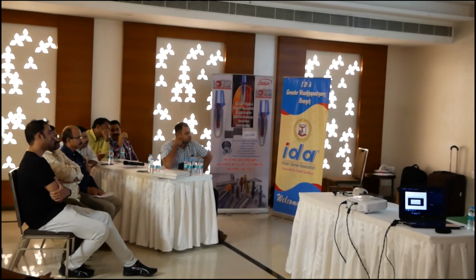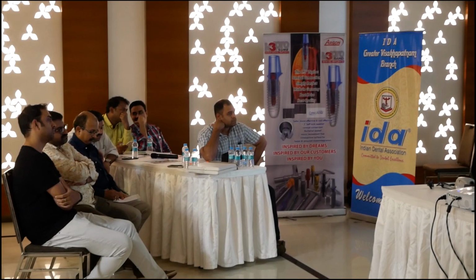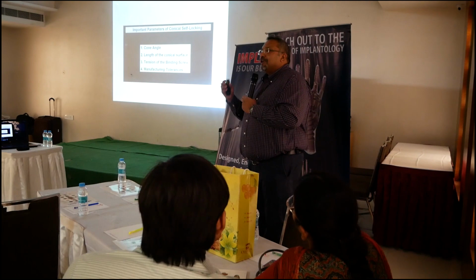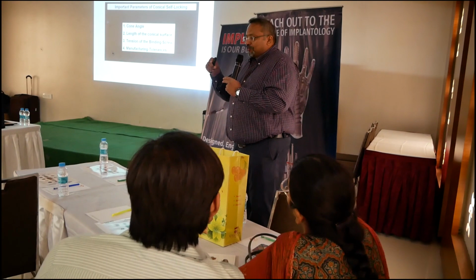Tension of the binding screw also helps in keeping the whole thing in place. But once there is a micro weld, then there is no need for the binding screw. But the screw here has a different function. The screw is actually used to make sure that the abutment goes to its final place. If you don't have the screw, you have some very good implant systems in the market where you're supposed to keep an abutment there and tap it.